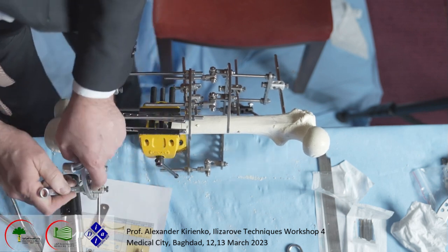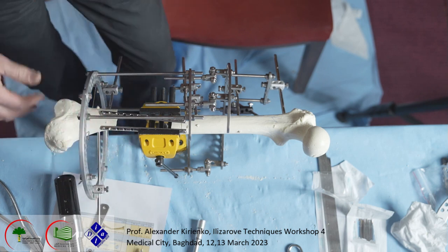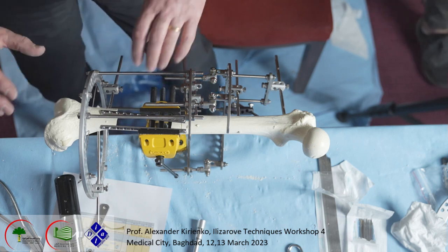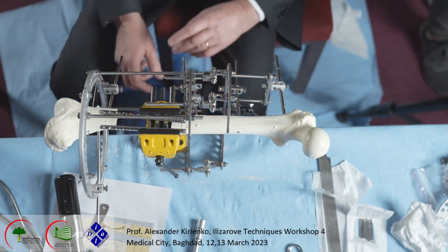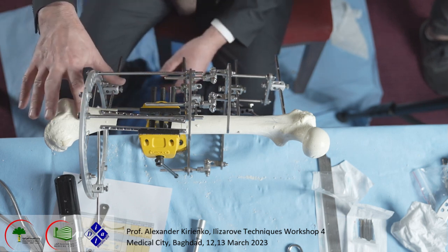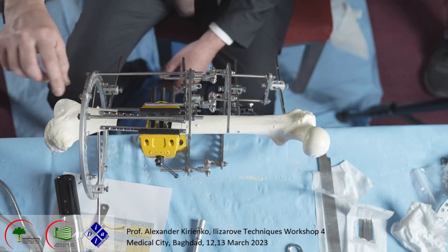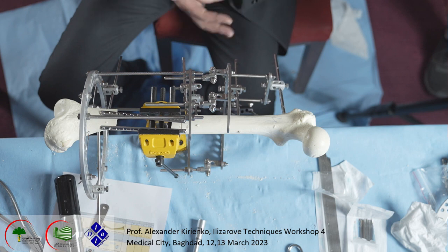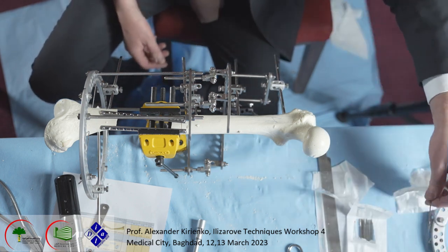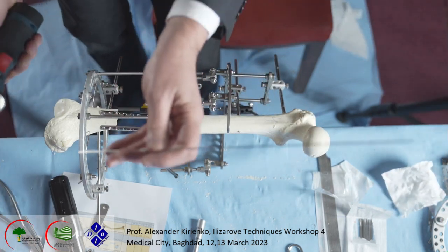And the same principle, when you put this half pin, flex the knee, do a little bit of cutting of the skin and the muscle under the skin in the way that your knee will be flexed. Just in the beginning, you should achieve good flexion. If we want, it is possible to put another wire in the distal part, but not so much crossing, because one wire is maybe not enough in this case, because the frame should stay for a long time, and we should maintain it for long.